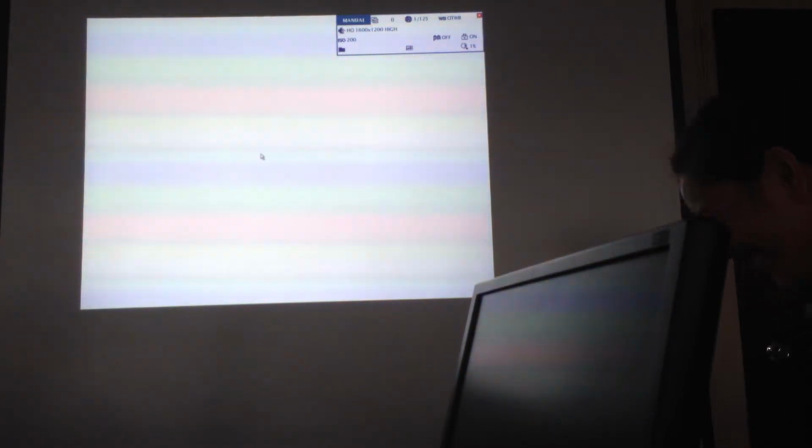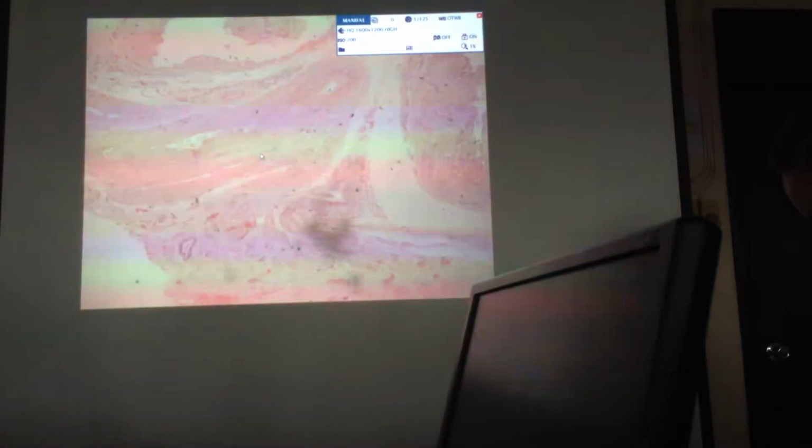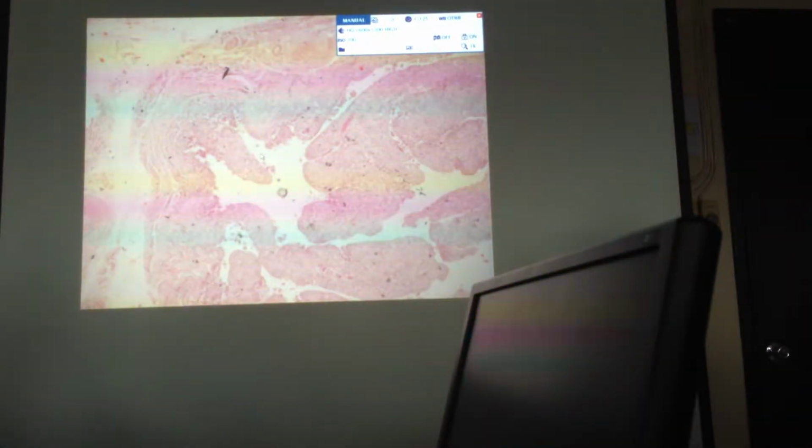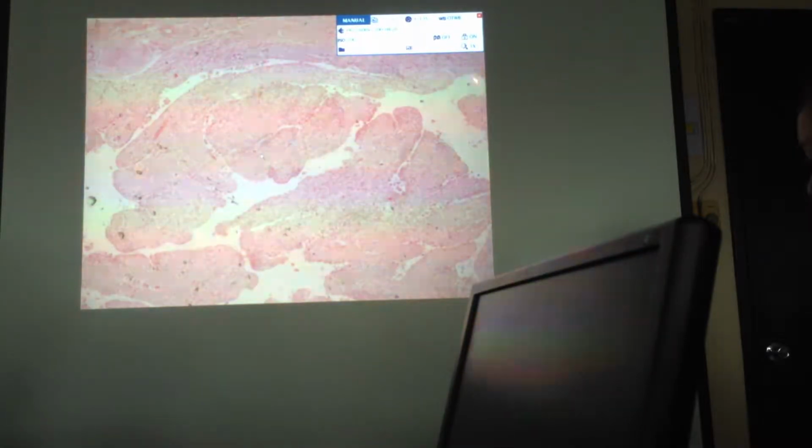Wala na sila. Ano yung sunod natin? 78. 78. So, this slide is a review for you. We have encountered this one in inflammation. Chapter inflammation.